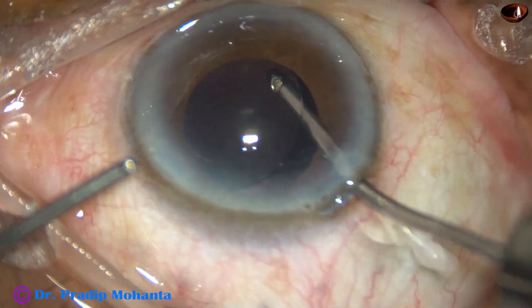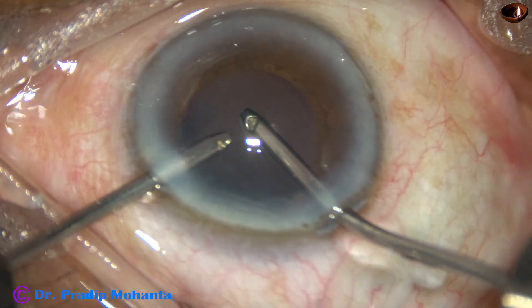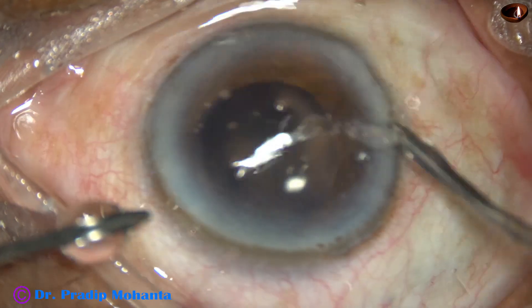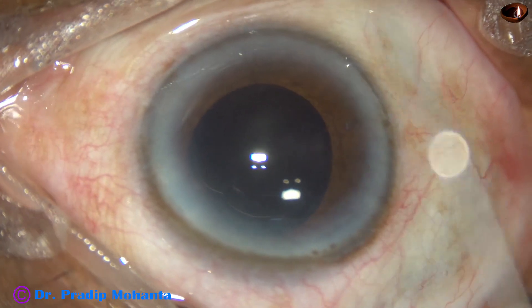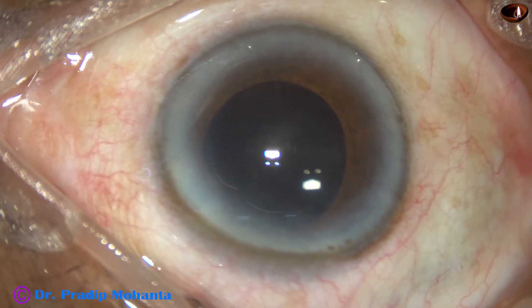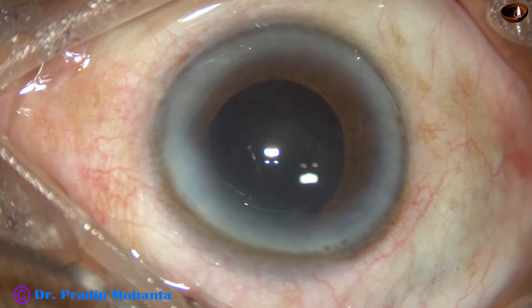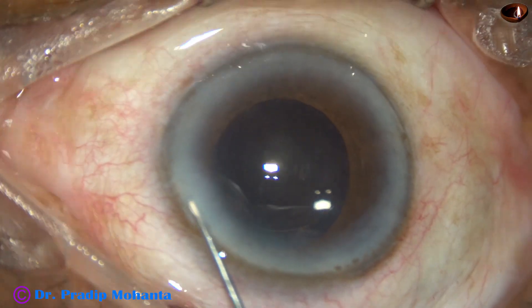I irrigate behind the lens — there should not be any viscoelastic trapped behind the lens. In many instances, trapped viscoelastic behind the lens may cause raised intraocular pressure and can cause steamy corneal edema, making the patient very uncomfortable. So all the retained viscoelastic should be removed.